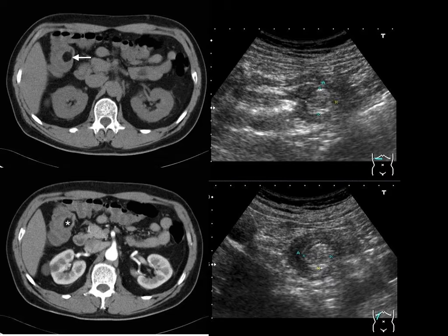Sometimes if you are inexperienced, you lack senior ones to supervise you, but you have the traditional ways, CAT scan, X-ray, something like that, to diagnose the patient's condition. If you also want to learn ultrasound, you can compare it to the traditional imaging modality. Like this, we can see this non-enhanced and enhanced one. The leading point is this one.